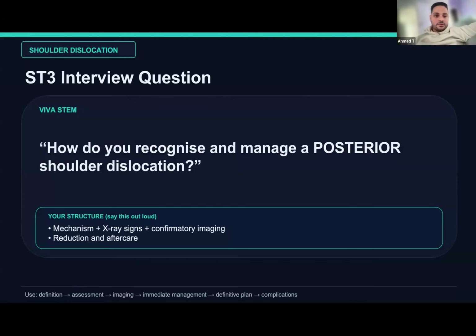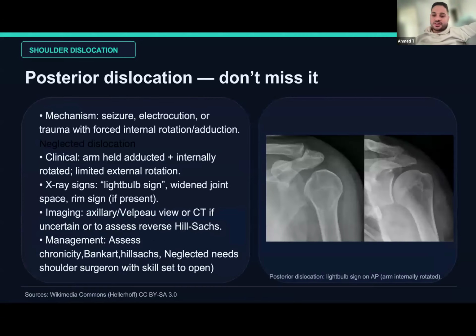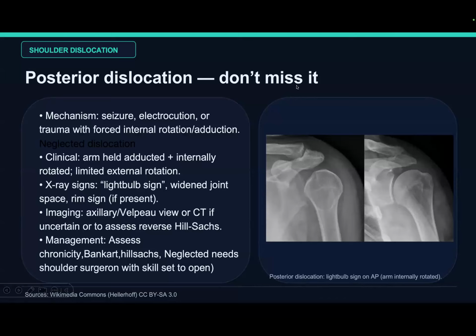The next question is about posterior dislocation. So the same question might come, but with this X-ray. Can someone describe the X-ray for me, please? Yeah, I can go.